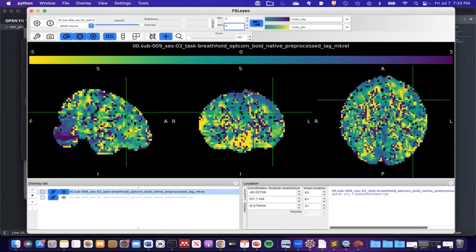So this is the basics, the quick rundown on CVR mapping with the lag GLM and the outputs. There are more outputs to sift through, and I'm happy to. As I mentioned, here is the summary of Phys to CVR outputs, since we didn't have a chance to go through all of them.